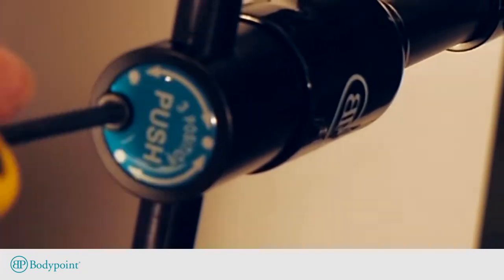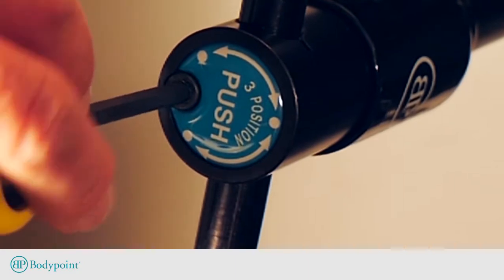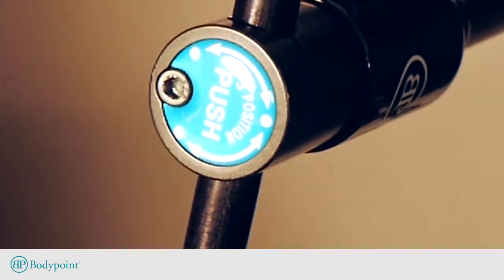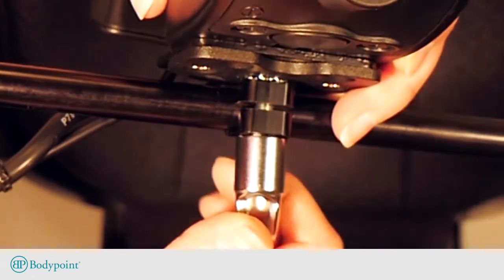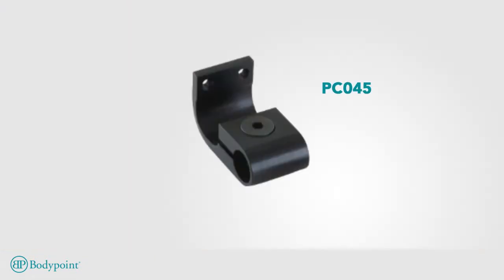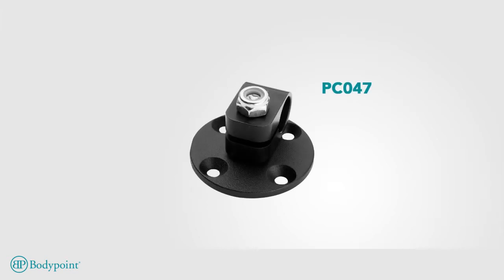Slide the midline arm into the rotating shaft. Most often, the short end of the L-shaped midline arm will be clamped into the rotating shaft, but either end can be used to accommodate the ideal driving position. Install the joystick adapter. The joystick adapters suitable for Permobile joysticks are PC045 for the older Pilot Plus, PC046 for R-Net joysticks, and PC047 for compact remote joysticks. If you need help determining the joystick adapter or other information, see bodypoint.com/midline.